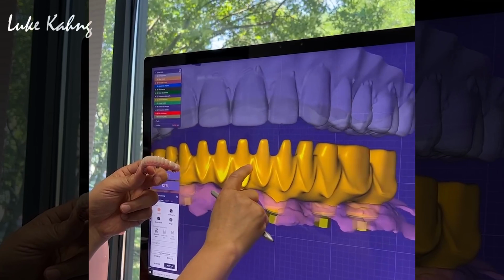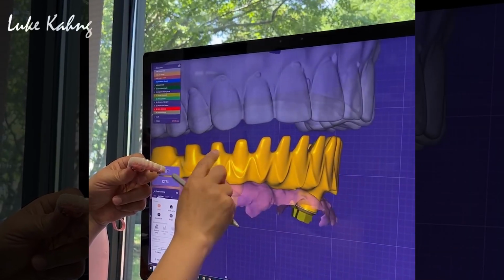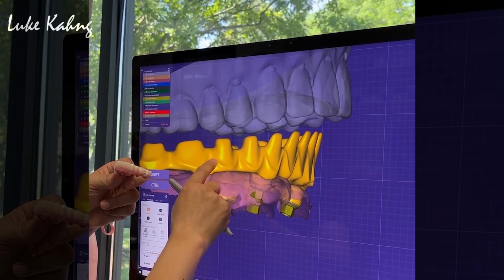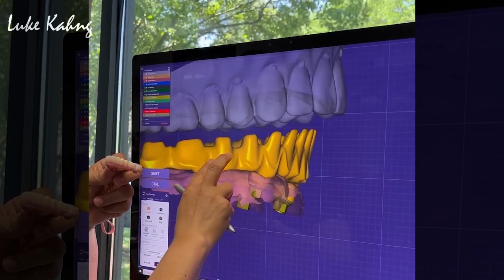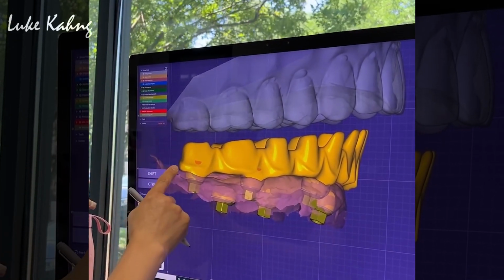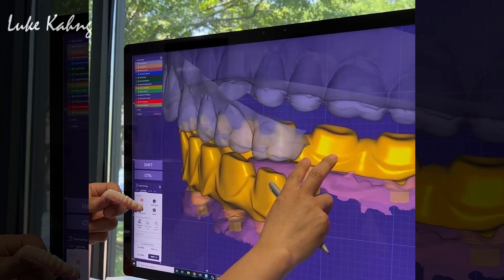Okay, now. Right. Now you said not much room for here, so you can add here a little bit more higher. So we got more thickness, that's good. Here, yeah. But you can narrow down here. So minimum. I don't need this, because half tooth is fine. Better. Alright, now look at this underneath. It's pretty good, yeah.